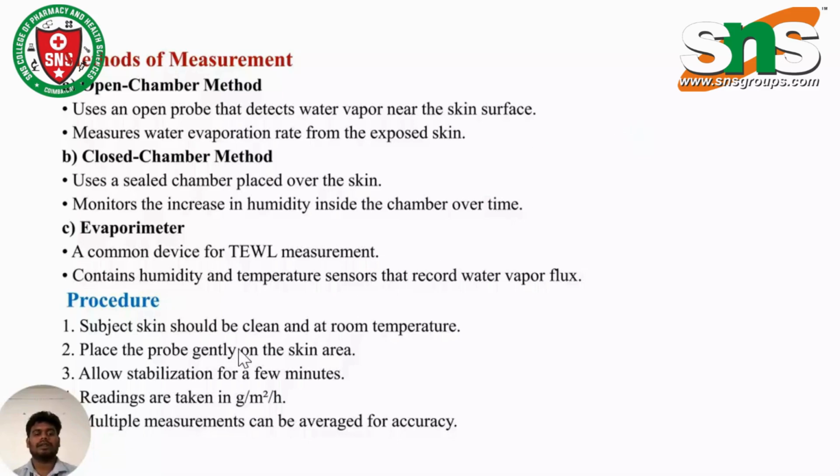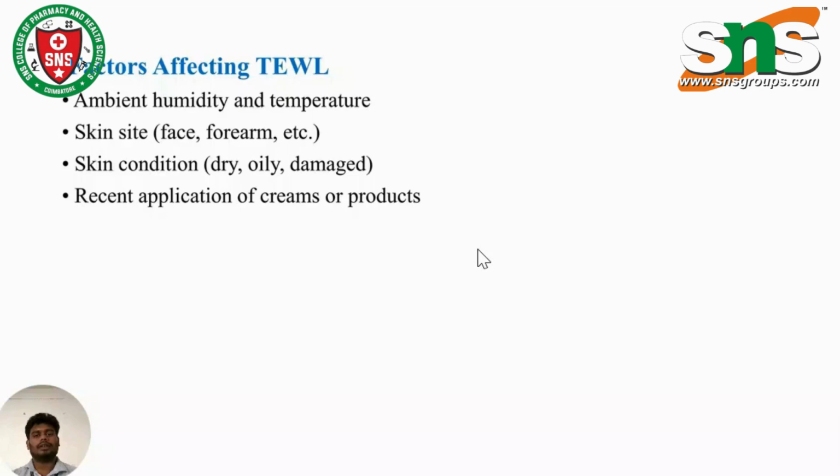And then the procedure, the normal procedure for transepidermal water loss: room temperature, a properly gentle cleaned skin area, and then stabilization, and then reading, and then averaging for accuracy. Factors affecting TEWL are ambient humidity and temperature, skin site, skin condition, and recent application of creams and products.